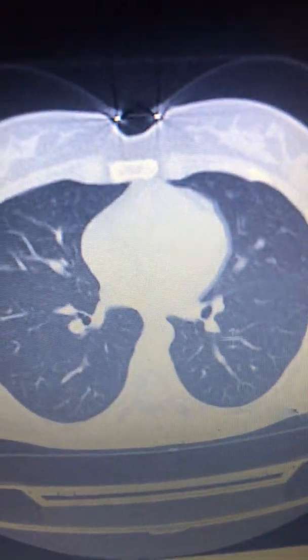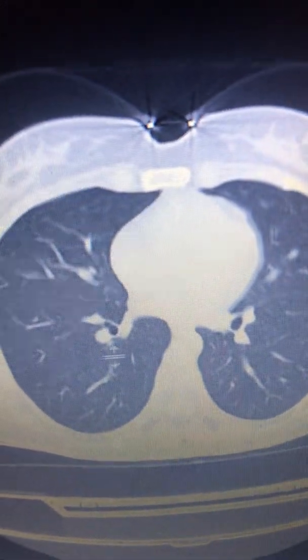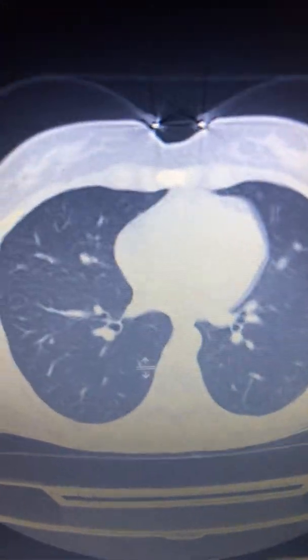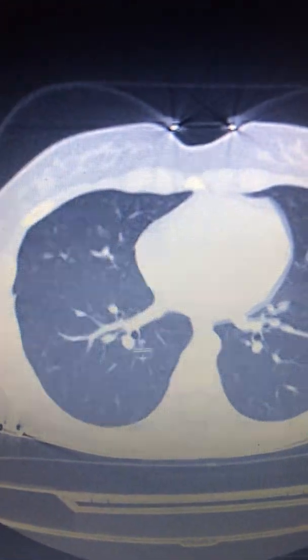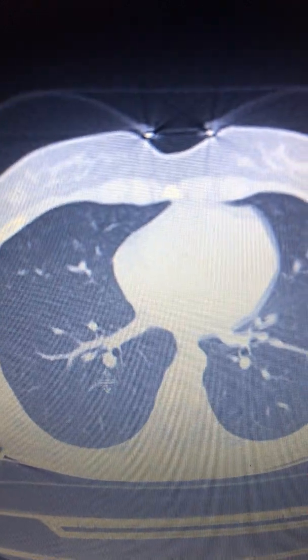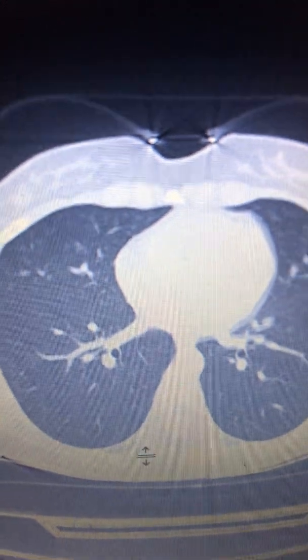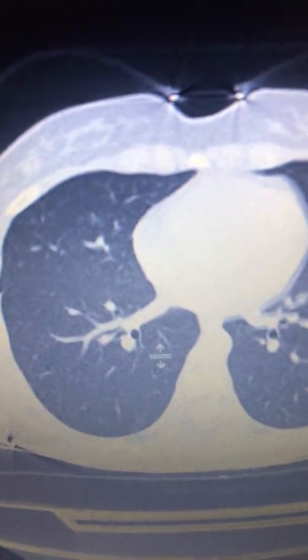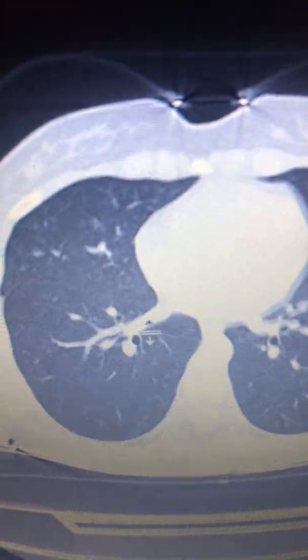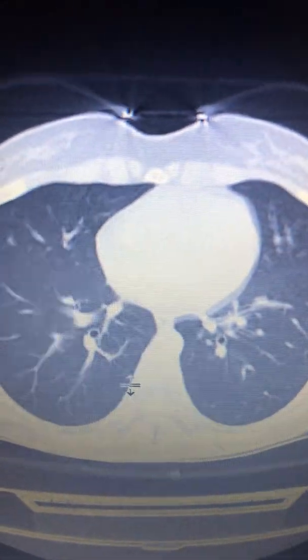We're going on. There are so many bronchi, and the vessels spread all over the lungs because there is an ongoing acute bronchitis. There are so many spherical things, but these are not the lesions, but these are the sections cut through and showing the vessels or the phlegm-filled bronchi. We're going on, going downwards.